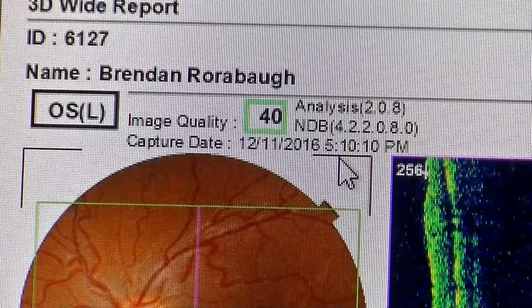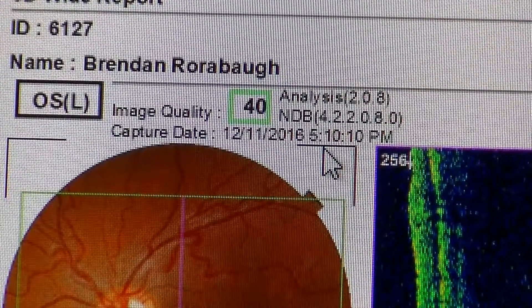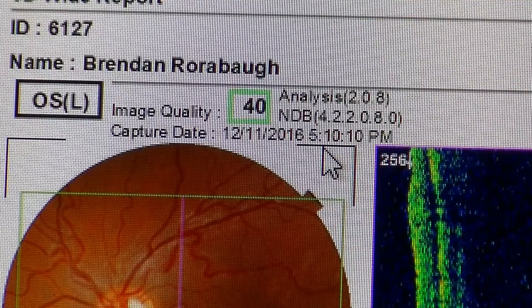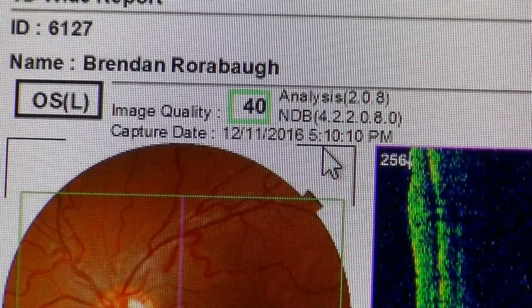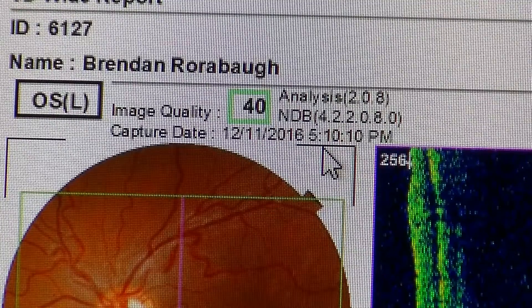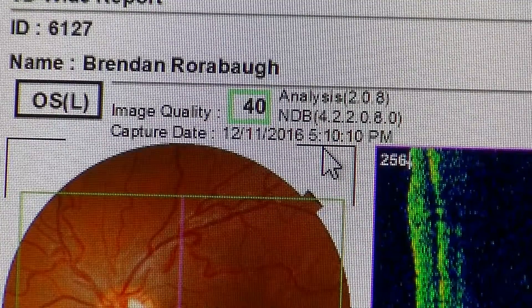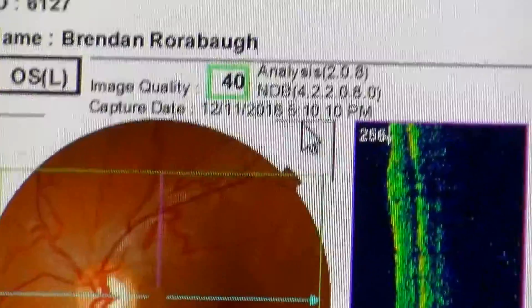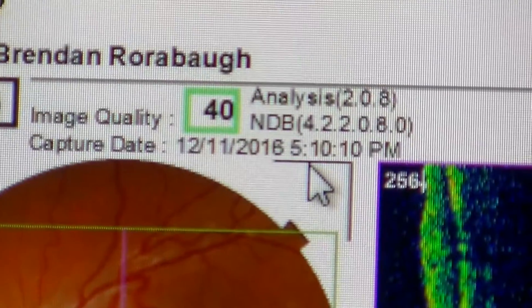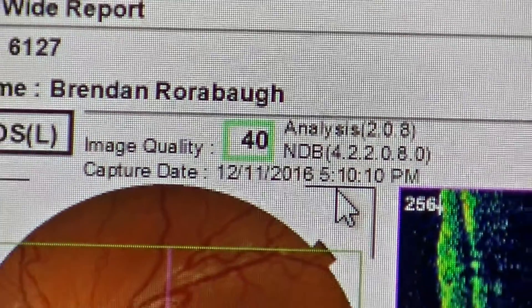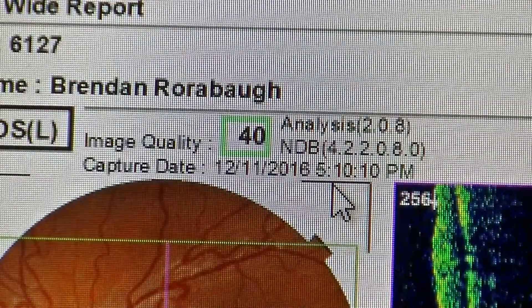Chances are, if you're in any time zone other than the Eastern time zone — since I'm in California and we're on Pacific time — that time right there will be three hours later than the time on the computer I just showed you. Because what happens is, on the 3D OCT, they set the date and time in New Jersey from Topcon, and this time right here will be off by whatever time zone you're in. Two hours off or three hours off if you're in Central or Pacific time zone.